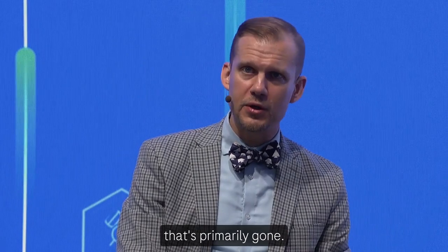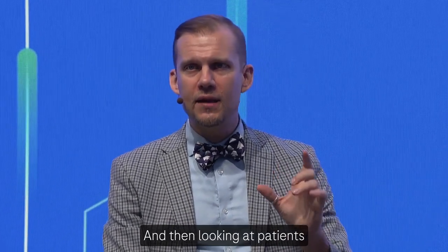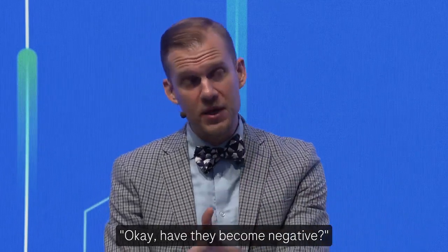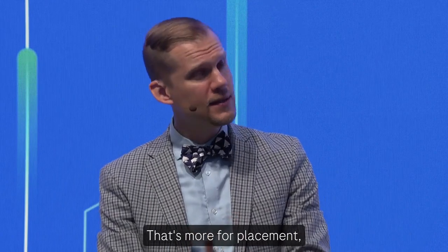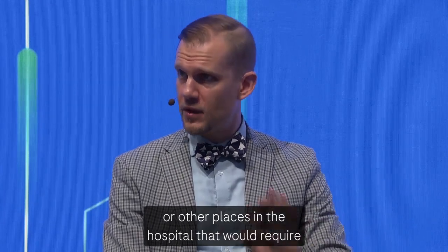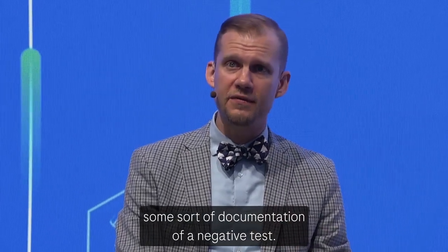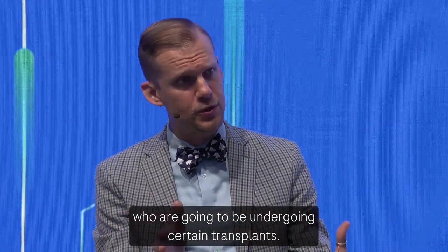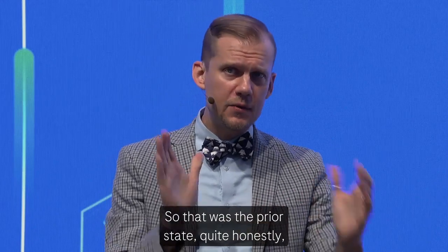That's primarily gone. And then looking at patients who were positive, trying to say, okay, have they become negative? That's more for placement, particularly for long-term care facilities or other places in the hospital that would require some sort of documentation of a negative test. And then for transplant patients who are going to be undergoing certain transplants. So that was the prior state.